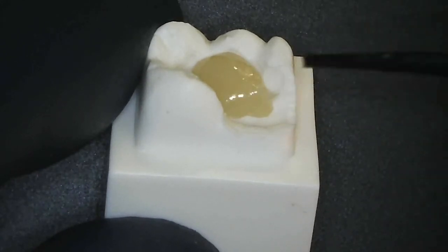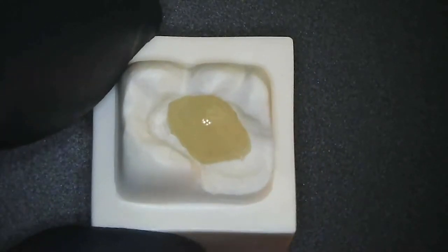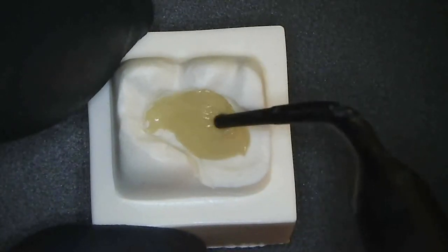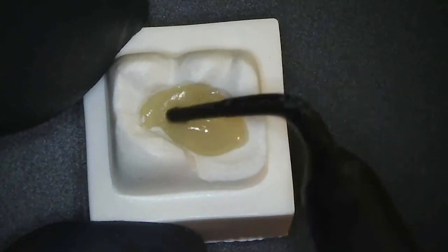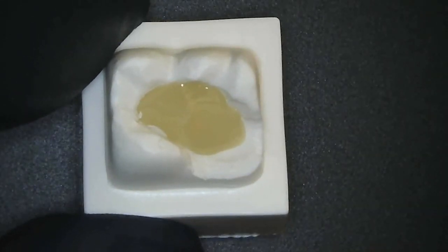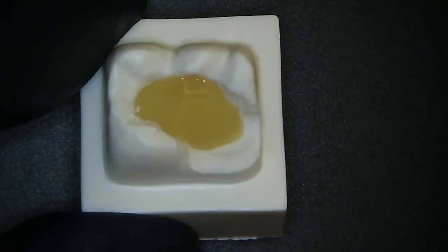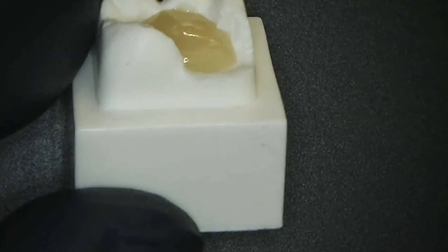I'm replacing the dentin completely with this. As we move it around, you can see the glass fibers that are part of the matrix — incredibly strong. We cure it up, and then you can put composite on top of that, and this is extremely fracture-resistant.